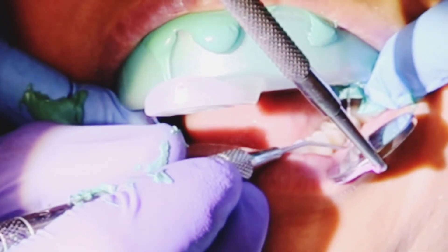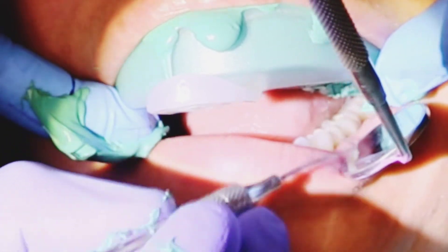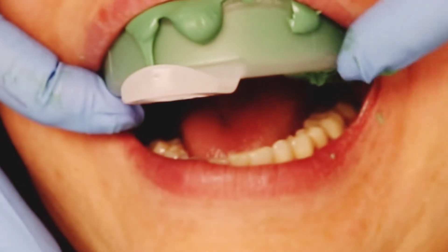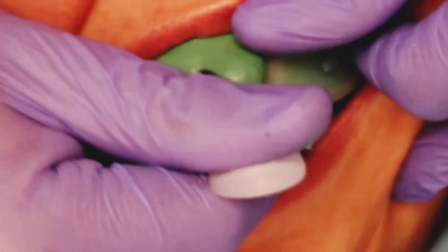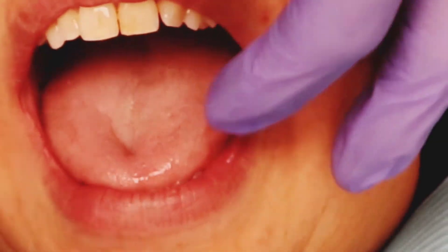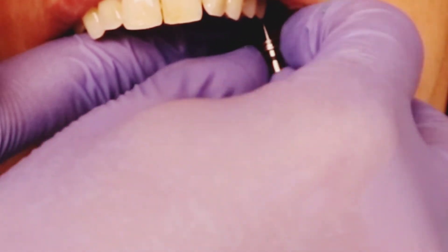Once it's kind of set, I go in with an explorer or a perio probe and remove any little extra material inside the area of the impression coping. You can put cotton pellets in there, but it's actually quicker for me to do without. Then you unscrew everything with your hex tool, remove the impression, and you'll see a very nice impression.